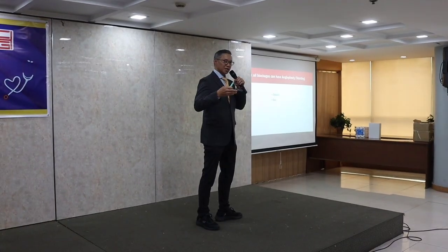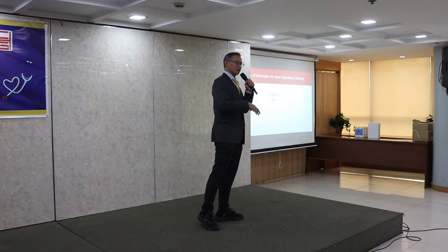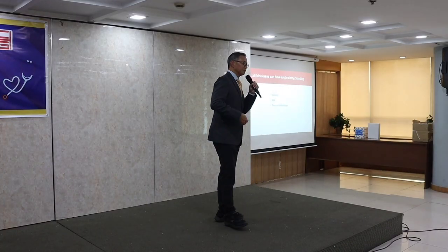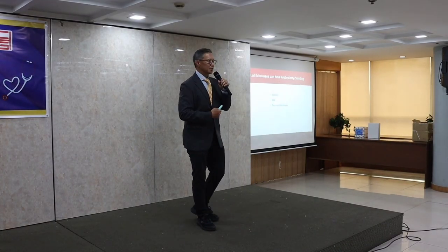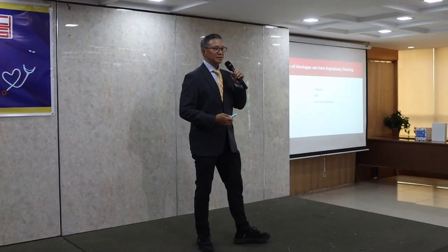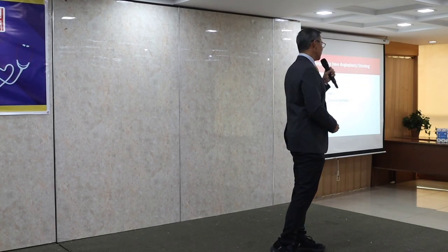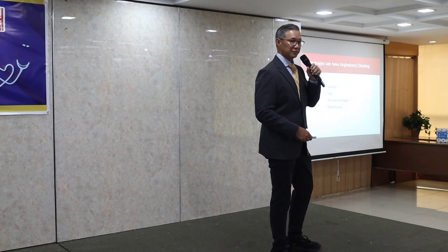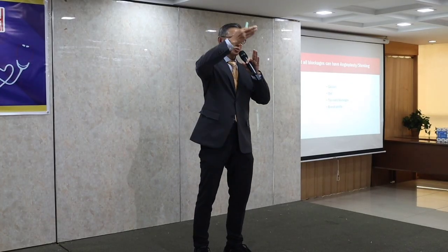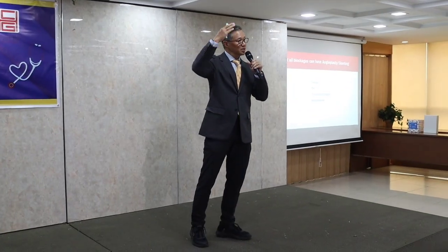Some people, kung masyadong maraming blood clot, napatunayan, pag maglalagay tayo ng stent, the chance of the blockage coming back in an area of clot is much higher. And then some people, sobrang daming blockage, gagamitin na natin na stent, 12, 15, 18 stents, hindi na siya practical. Diba? Not that it cannot be done, but pag ganun na kadami, we have to think about other alternatives. And then some patients have blockages in areas of branching. So may malaking ugat, naghihiwalay sa dalawang malaking ugat, and all of those branches may bara, mas mahirap siyang gawin.